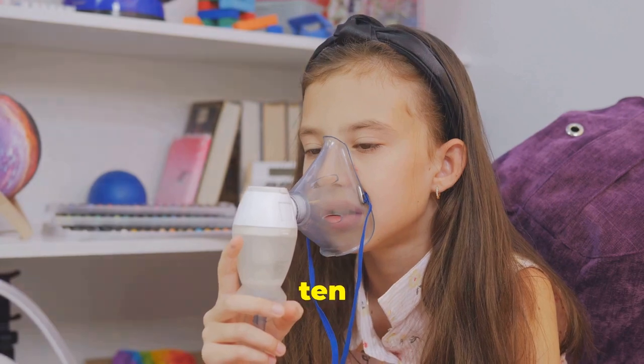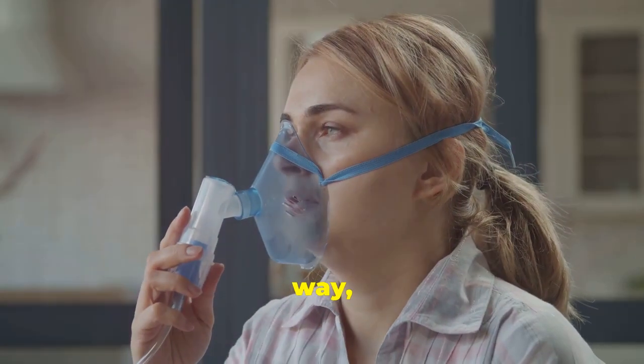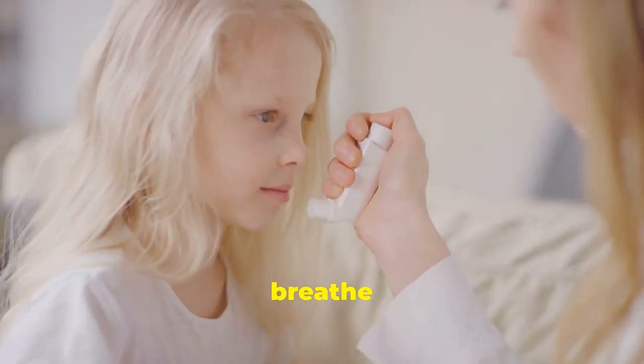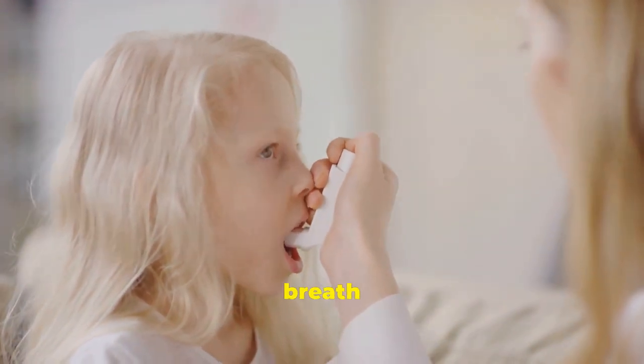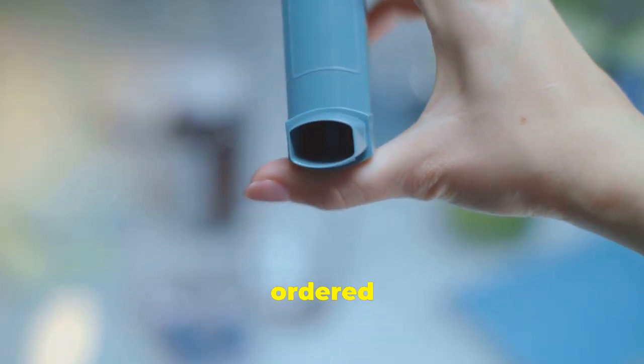Shake your inhaler for 10 seconds and place it into the spacer. Exhale your air all the way. Place the spacer in your mouth and close your lips. Gently spray your inhaler. Breathe all the way in slowly. Hold your breath for 10 seconds and exhale. Repeat as many times as ordered by your doctor.